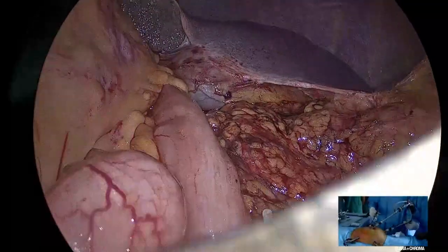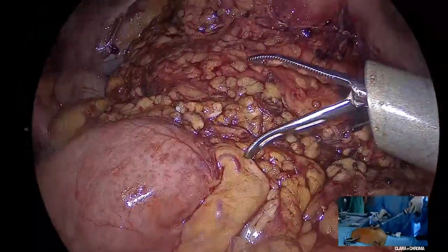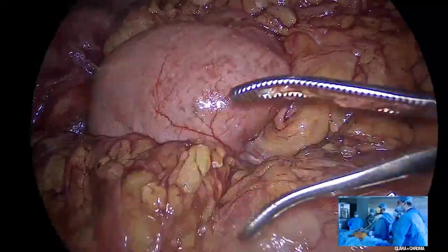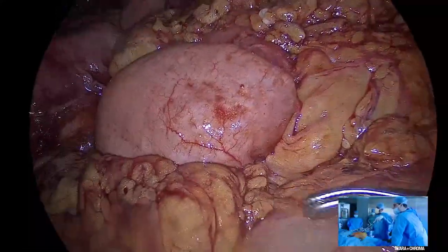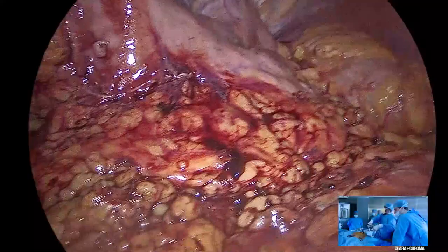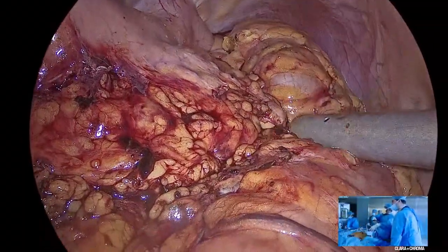Absolutely. So the hepatic flexure is completely mobilized and the pedicle is there. So we have done the entire cecum, ascending colon, ileocolic pedicle at its origin, done the hepatic flexure. We have also done the middle colic over here, right at its origin near the pancreatic uncinate. Because it's a proximal transverse colon tumor, we have taken the middle colic at the origin, and I have dissected all the way up to the distal one-third of the transverse colon purely because I wanted to do the stapling somewhere at this level, where you see my port right now. So that's exactly where I'll be doing the stapling.